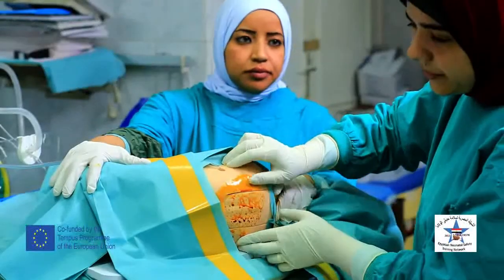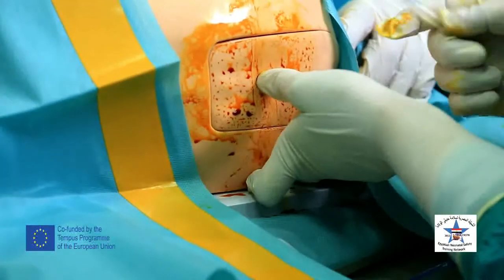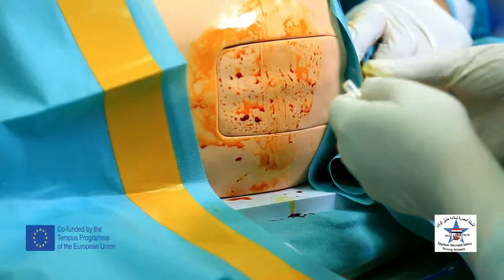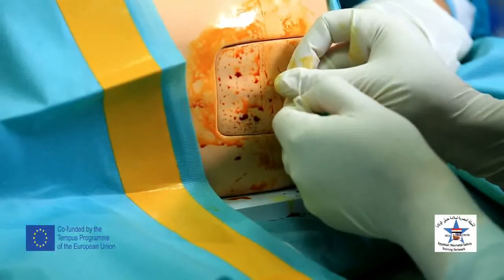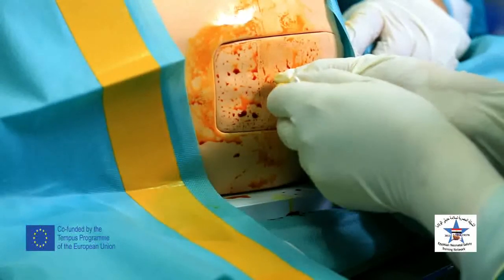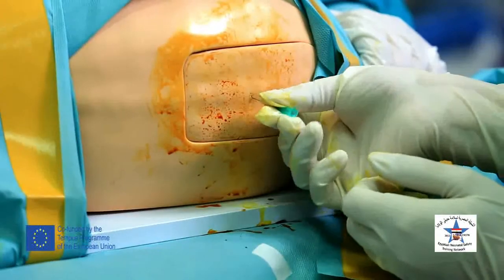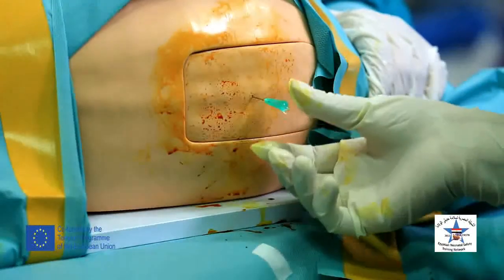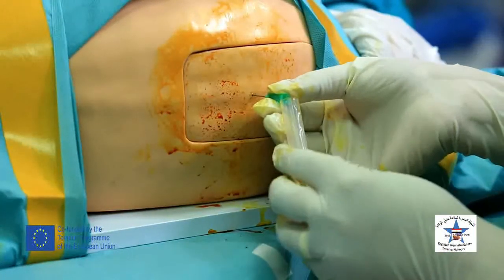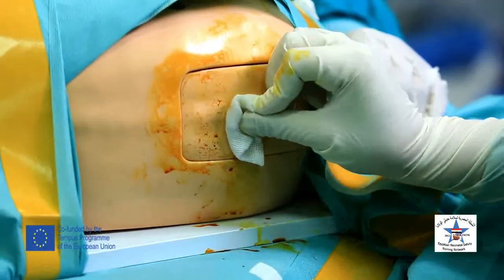Then we palpate the iliac crest on both sides. An imaginary line between the two iliac crests is opposite to the level of L4. In neonates, we can use a needle of a syringe in the midline and go perpendicular to the vertebral column. I will introduce the needle perpendicular at the level of L4 till I reach the flow of CSF and collect the sample in collecting tubes. I will remove the needle with pressure for about 1 minute.